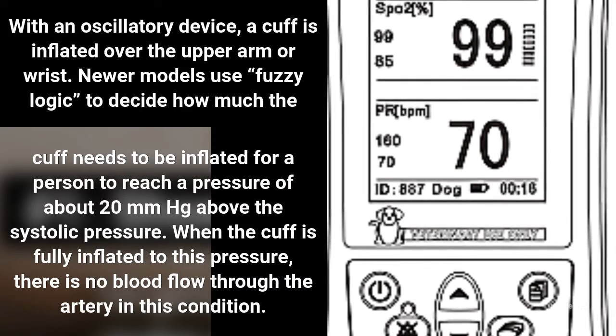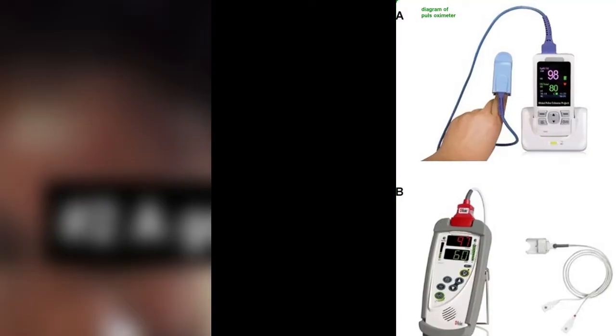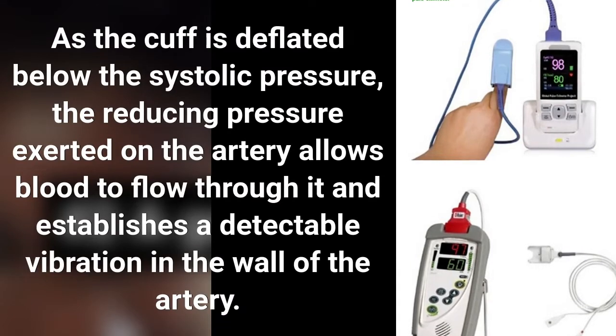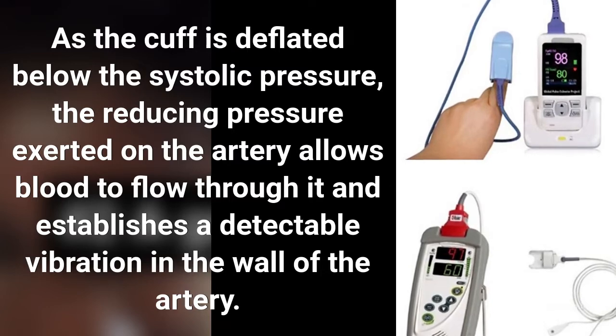When the cuff is fully inflated to this pressure, there is no blood flow through the artery. As the cuff is deflated below the systolic pressure, the reducing pressure exerted on the artery allows blood to flow through it and establishes a detectable vibration in the wall of the artery.